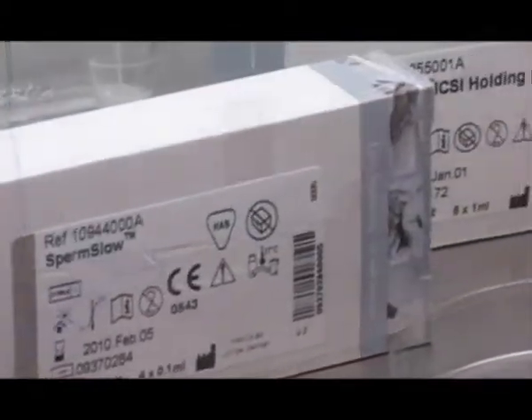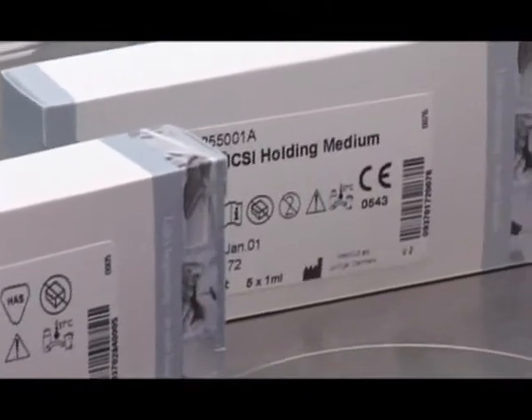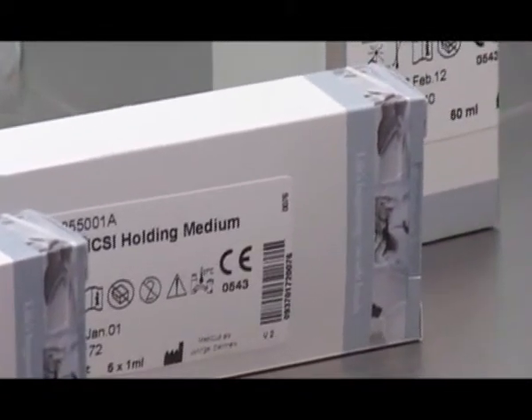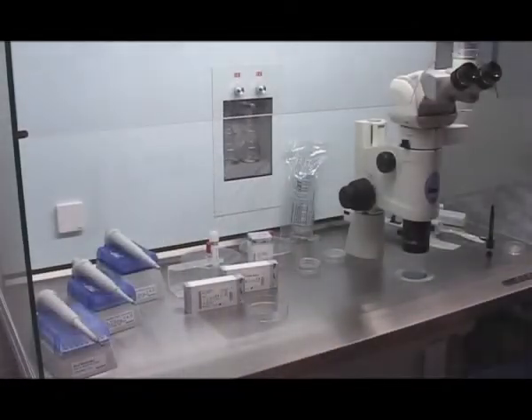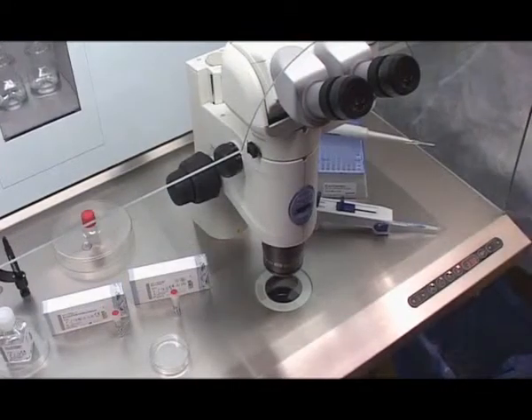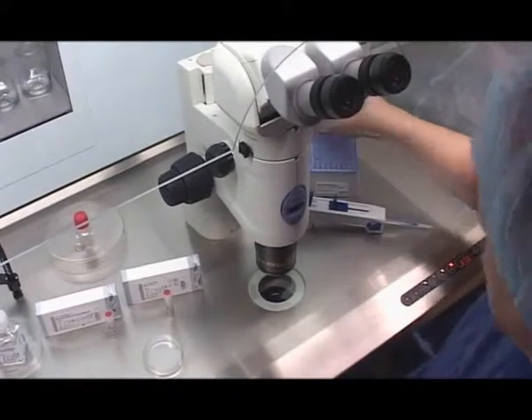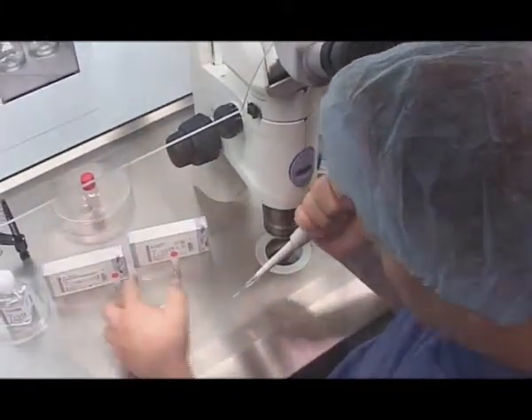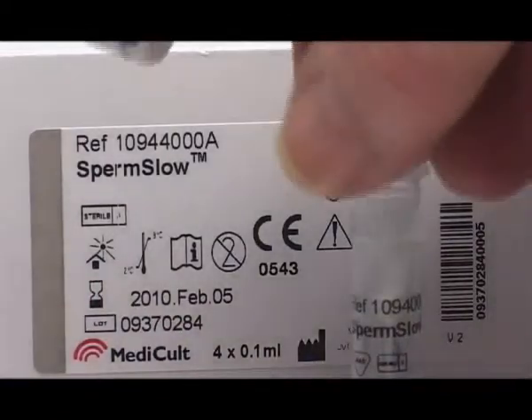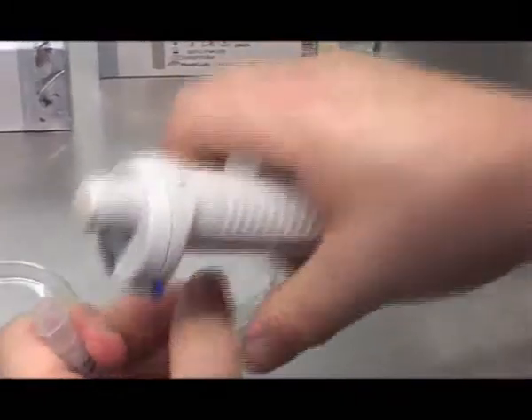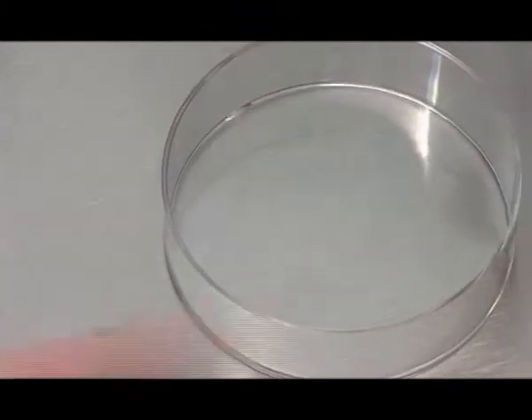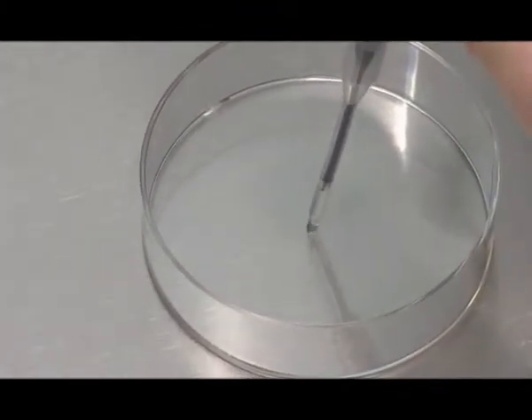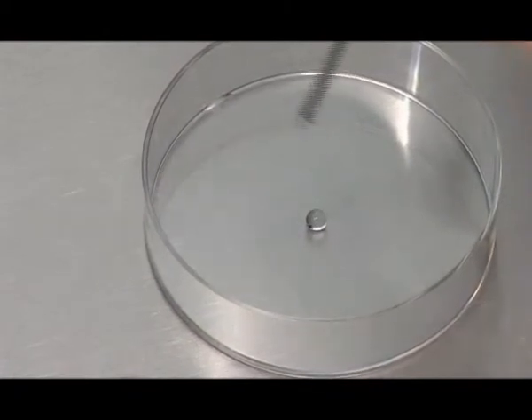Place the pre-cleaned packages of SpermSlow, holding medium and liquid paraffin oil on the heated surface of the workbench. Pipette two 10 microlitre drops of SpermSlow onto the bottom of the dish, which should be kept at 37 degrees centigrade during the entire procedure.